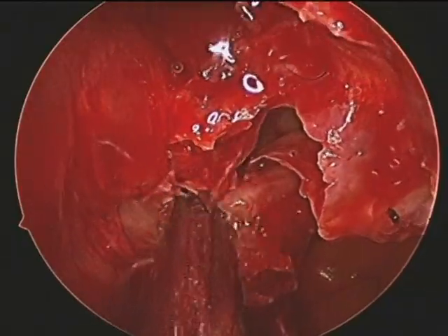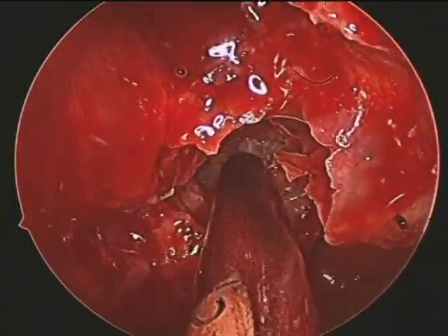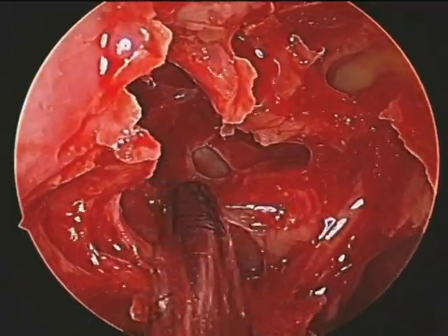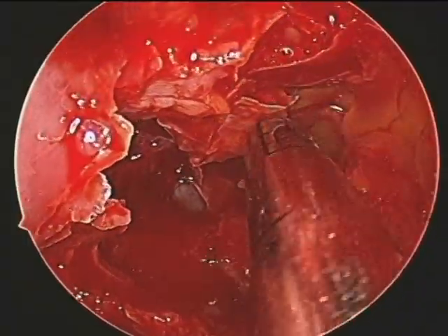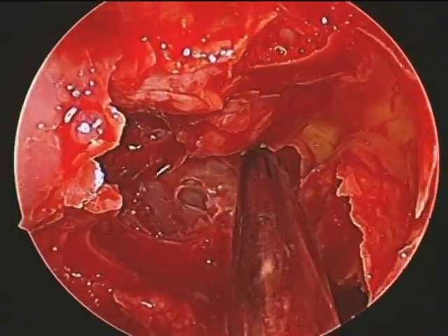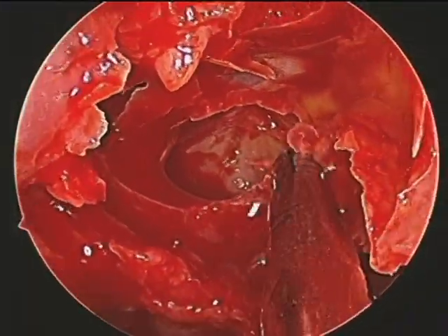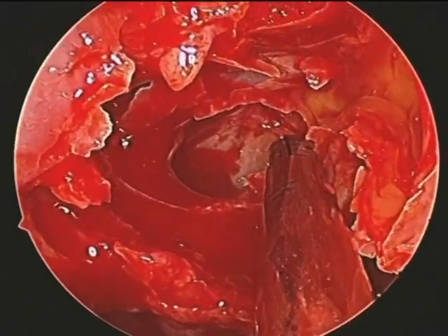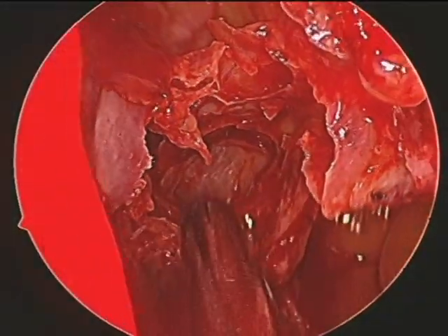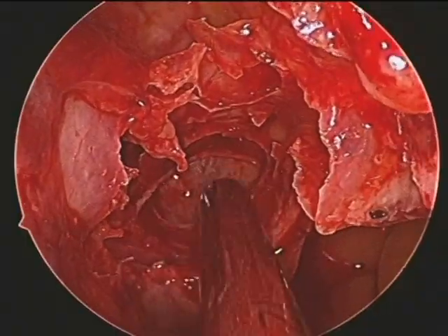We are now debriding the region of the anterior ethmoid artery. We debride the remnants of the bulla and then begin to debride the posterior ethmoid. That is the lamina papyracea bordered laterally. That is the diseased mucosa of the posterior ethmoid — you need to be careful at the roof of the ethmoid here in case the posterior ethmoid artery is also exposed, with debridement of the posterior ethmoid continuing.